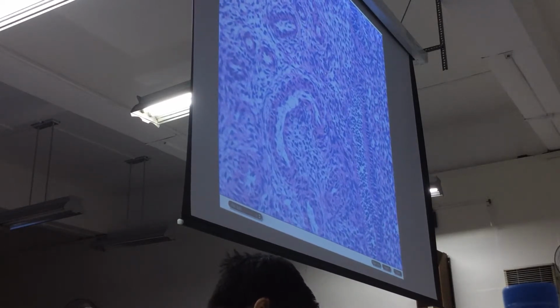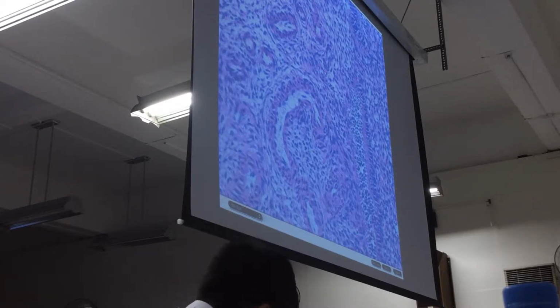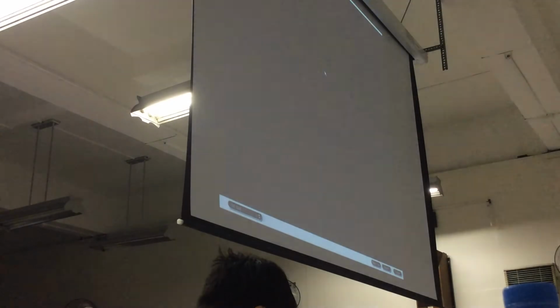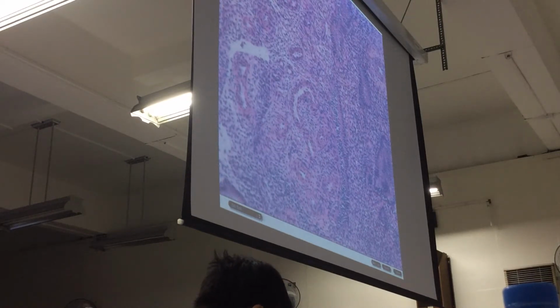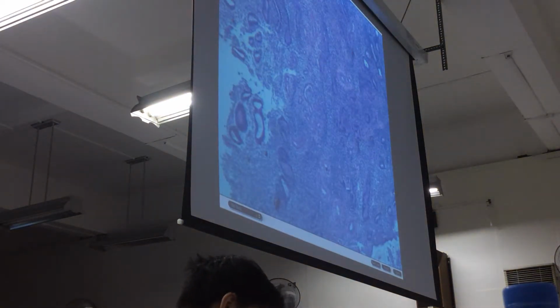And these three characteristics, varicized endometrial glands, sclerotic blood vessel groups, and fibrosis of the stroma, lead you to a diagnosis of endometrial polyp. That's slide number 12, labeled as simple hyperplasia, but actually it's an endometrial polyp.